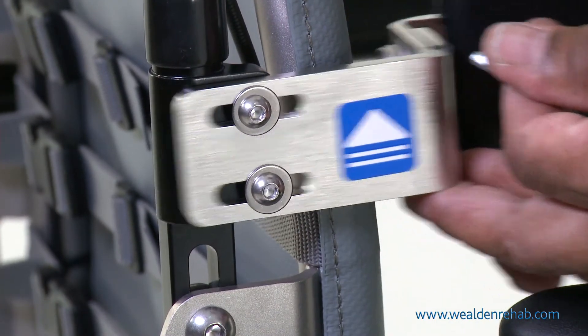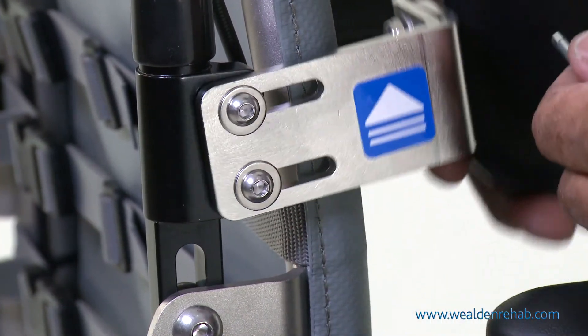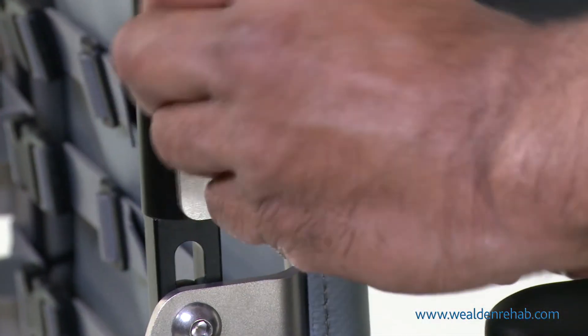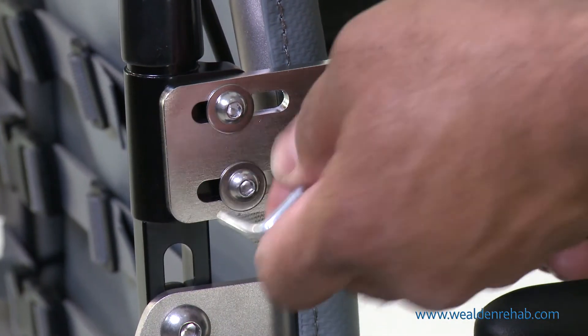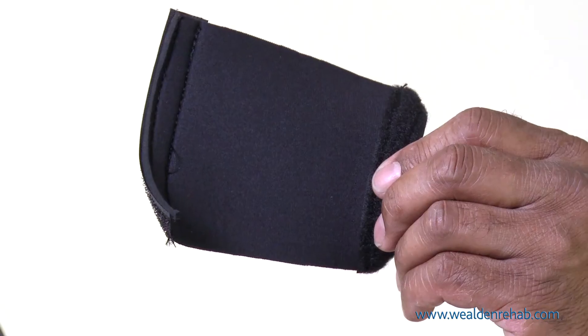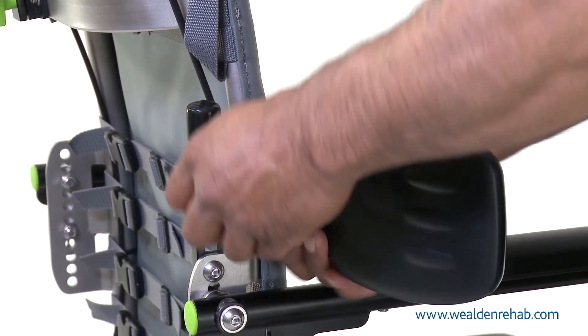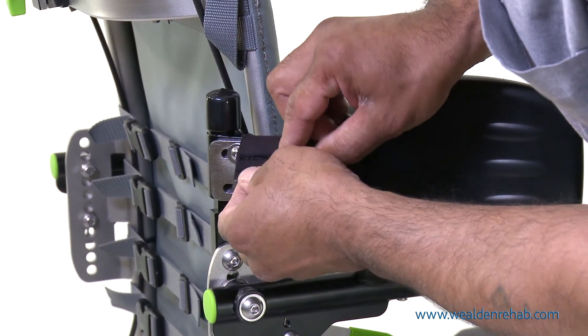Adjust the lateral support for depth and angle. The neoprene pad is easy to wrap around the support arm and adjusted for user comfort, using the velcro to fix it in position.